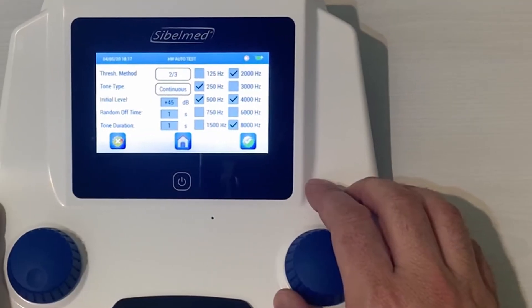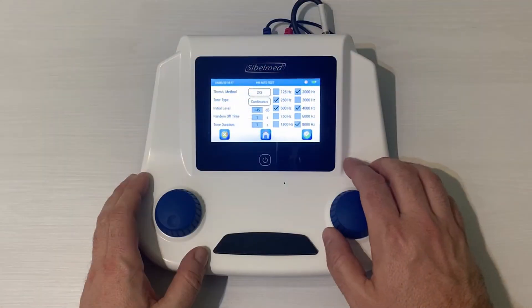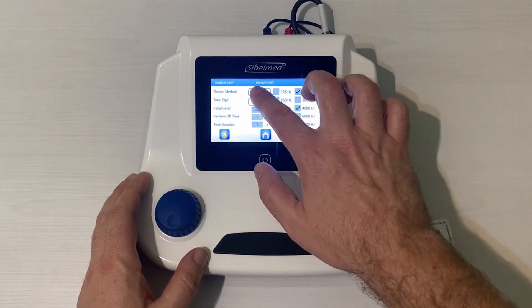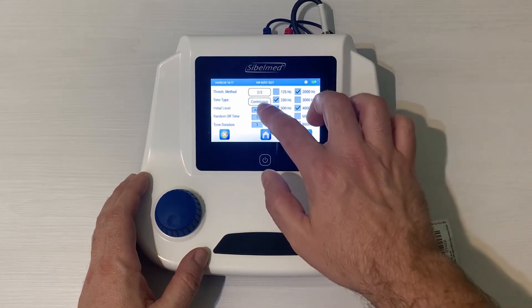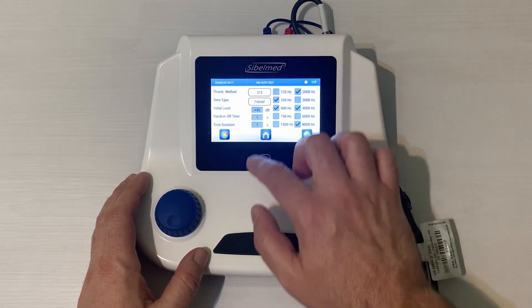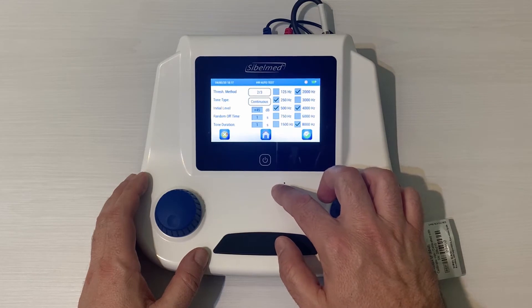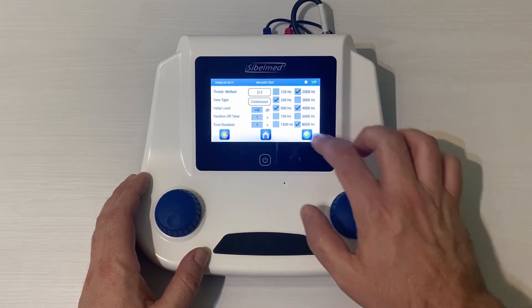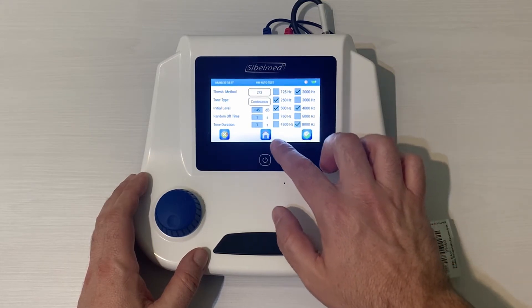A screen appears where the following automatic test items can be customized: the threshold method, meaning the quantity of right answers required by the patient to get the threshold level of each frequency — 2 of 3 or 3 of 5; continuous or pulsating tone; starting level; random off time and tone duration; and finally, the selection of 11 frequencies from 125 to 8000 Hz.